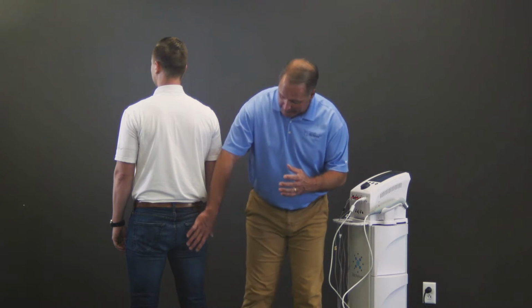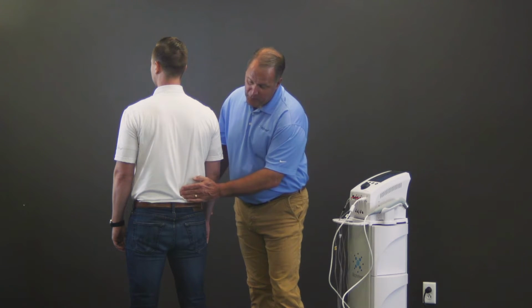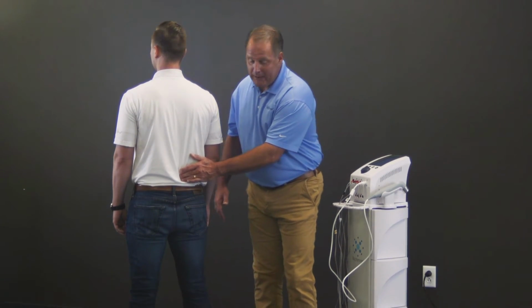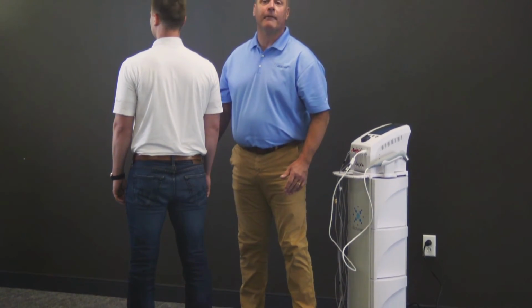An alternate application of vector scan is for low back pain. A lot of patients complain that they have pain running diffusely all the way down into their calf. So one way is to use that vector scan, turn it on automatic, and set the percentage to 100%. We can usually find a dorsal root problem, normally L4, L5. We'll put one pad of channel 1 at that dorsal root problem, and then put the second pad all the way to the outside of the calf, creating a really long X.